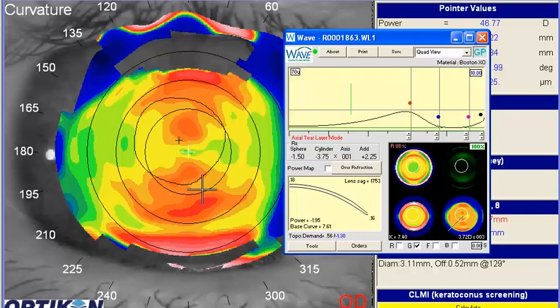If you do want to stay with this particular lens design, you might be getting some warping at this central thickness. You can increase that up a little bit. And then you might want to even look, I believe this patient was a prior gas perm wearer, so you might look back at what they previously wore and see, is it flatter than this or steeper than this? If it was flatter, if you're concerned about comfort, you could always switch this to tangential, which will give you about a half diopter more flattening in that lens design.